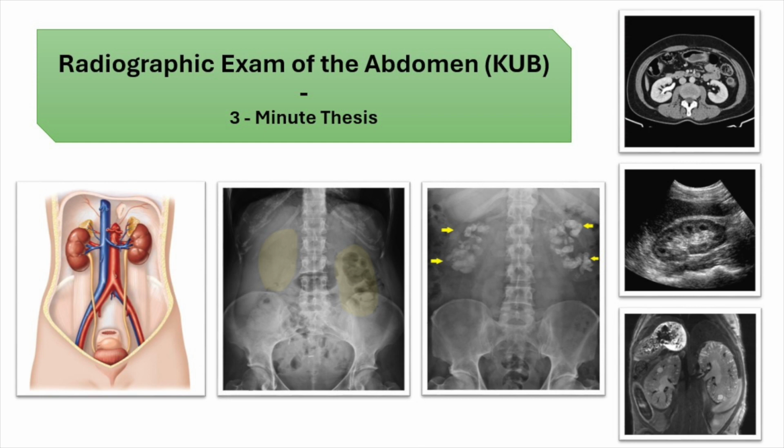Moving on to the third image on the slide, you can see an X-ray of a KUB system that has multiple kidney stones due to extensive calcification. Someone needs to drink more water, huh? But in all seriousness, a condition like this can have several underlying causes. And thanks to the science of radiographic imaging, this patient can now be diagnosed and move on to the treatment of their condition.